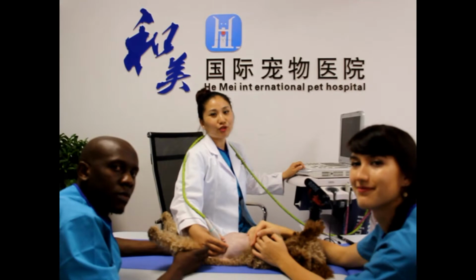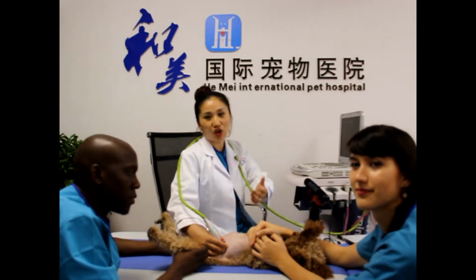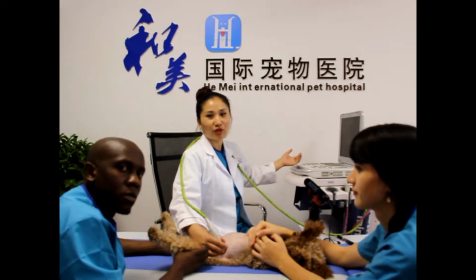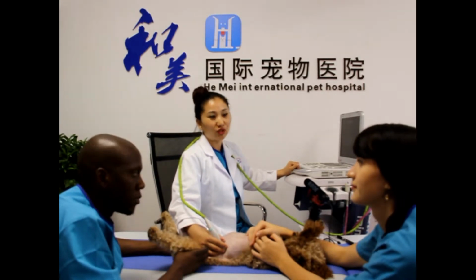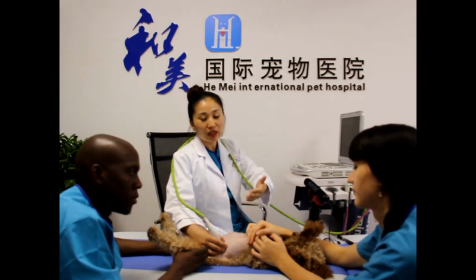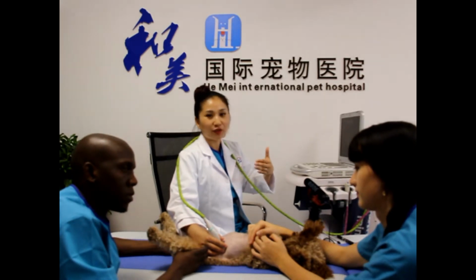Here we just showed you the image of the left adrenal glands for this dog. We have more images in our book, so you can read our book to see images of other dogs, because the shape of the adrenal glands could change from dog to dog, and also for a dog, the left side of the adrenal glands is always different from the right side.